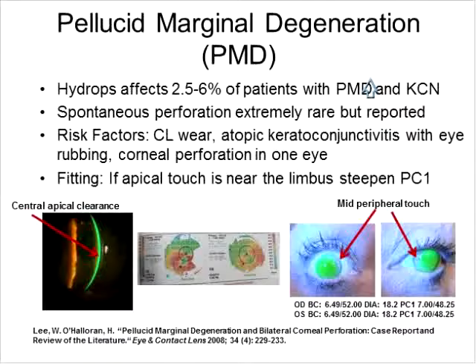Lynette, would you? We actually designed that lens at the Boston Foundation for Sight and provided it through the Dry Eye Shop to make it available to all scleral lens patients. So I don't think you can get it directly through the company. I think the only vendor is the Dry Eye Shop, and it's very accessible. And they have the plungers there. It's a great resource for all patients, not just dry eye patients, but keratoectasia patients as well. Okay, that answers Dr. Harmon's question as well.